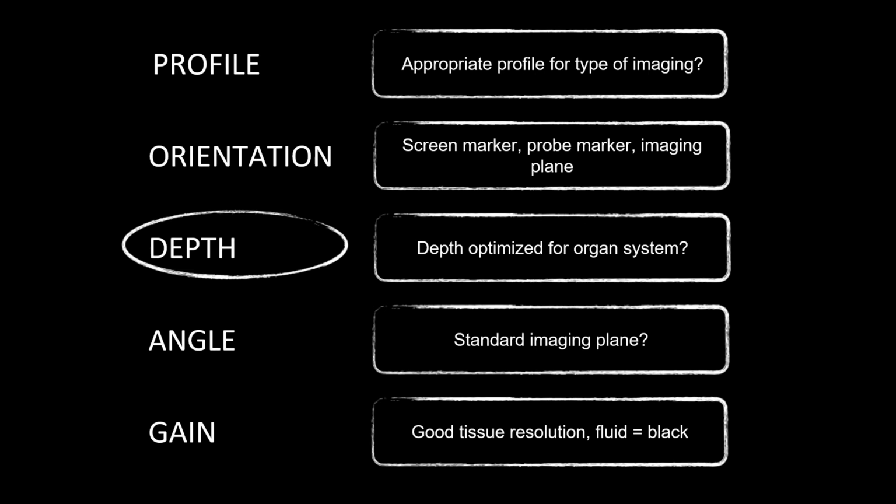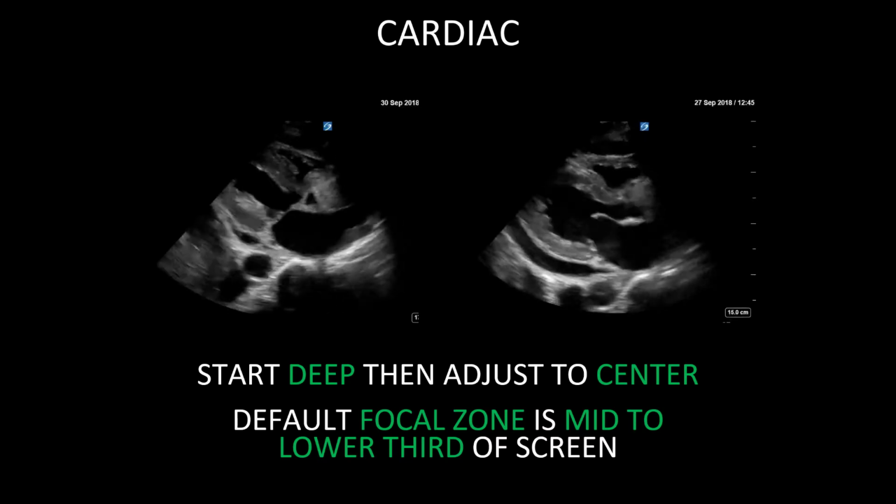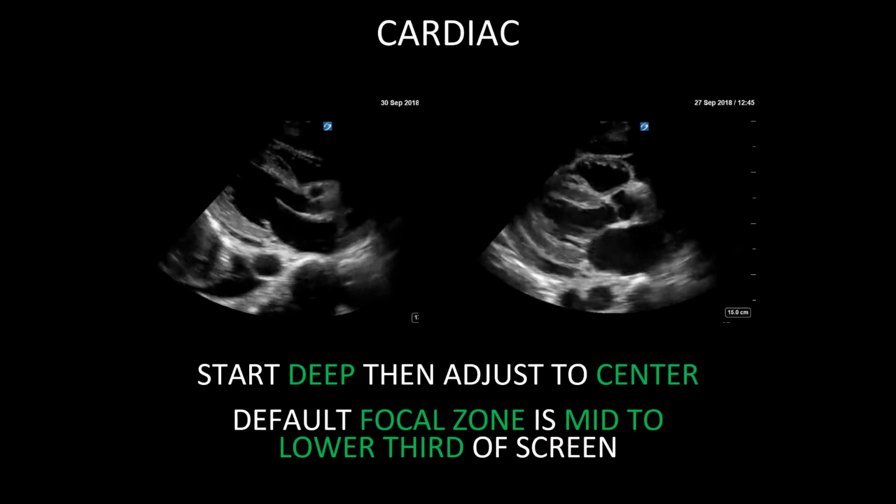One of the most common mistakes early on is to improperly approach depth in ultrasonographic imaging. An inappropriate depth at a specific moment of the exam has ramifications that extend from missing important findings to suboptimal image quality. First, try to start with more depth than you believe necessary for the exam. It is quite frequent that a too shallow depth may miss important findings.